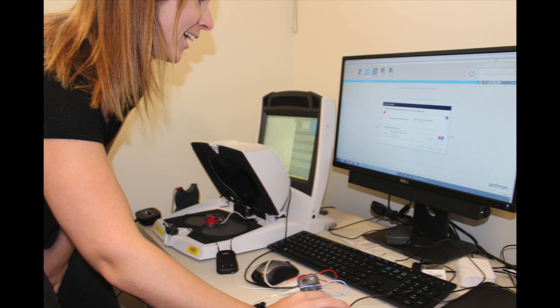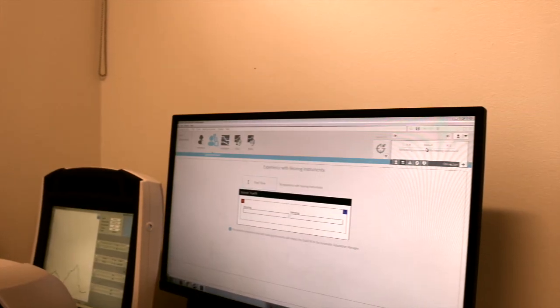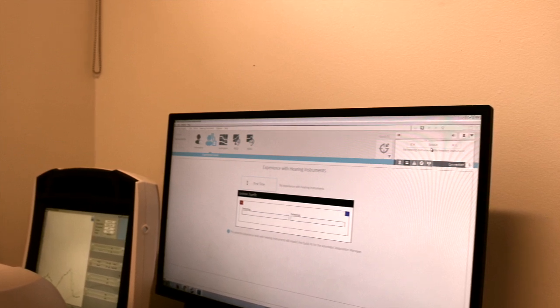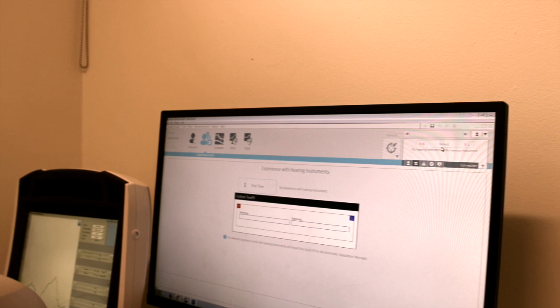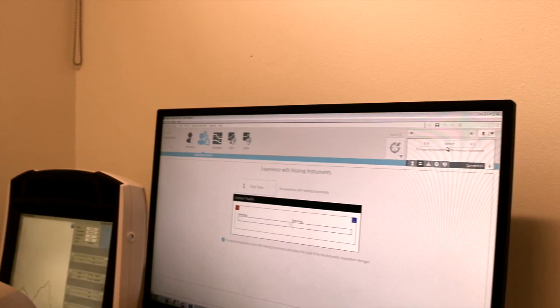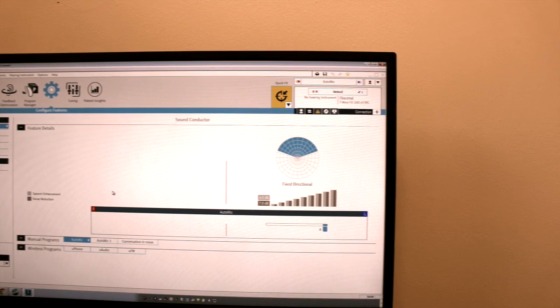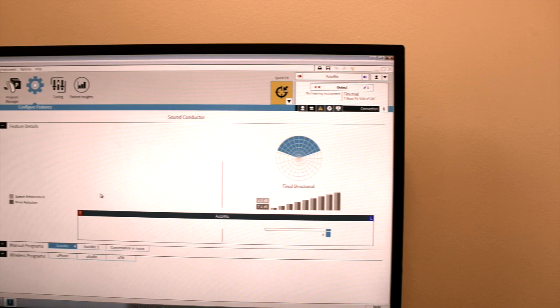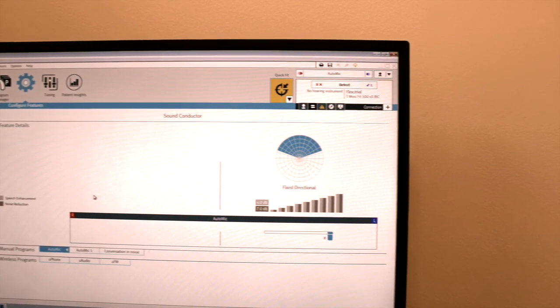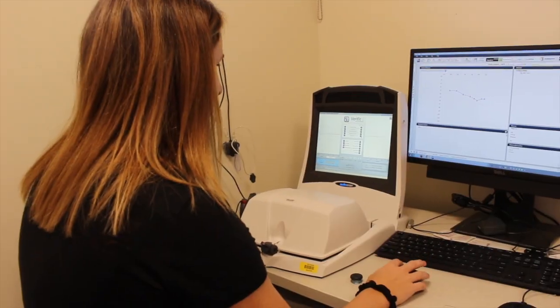First, we will review testing the validity of directional microphones in the test box. Before we began with our test box measures, we connected our Unitron hearing aid to the software in order to properly program the hearing aid with directional microphones. In order to demonstrate more robust results, we narrowed the directionality beam in the software. Once calibration was complete, we coupled the Unitron T-MoxiFit RIC hearing aid to the VeriFit.